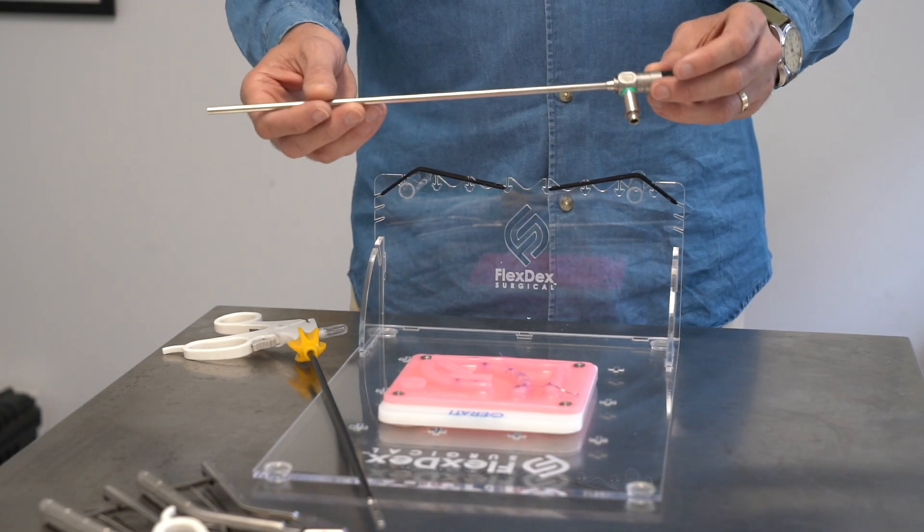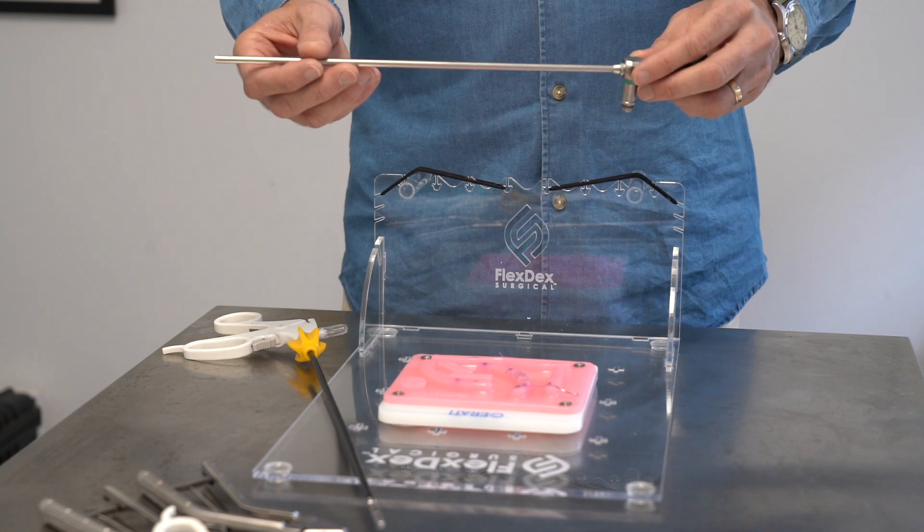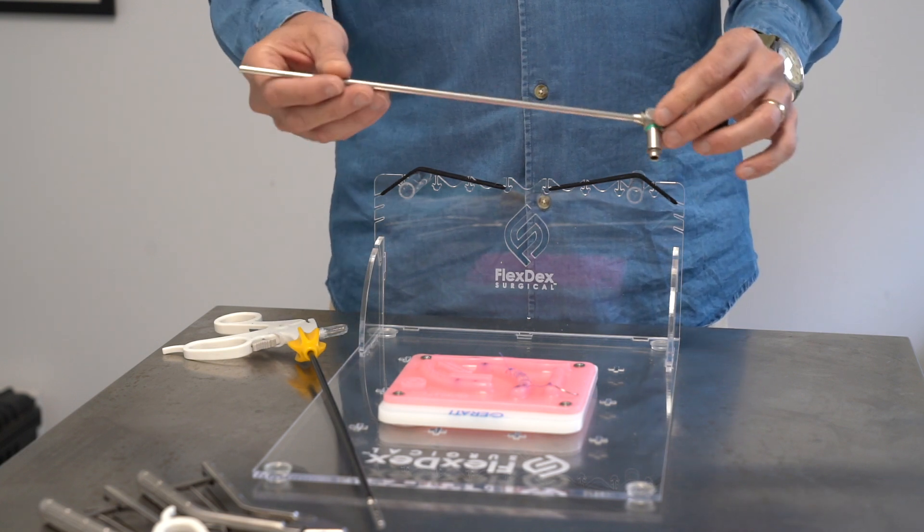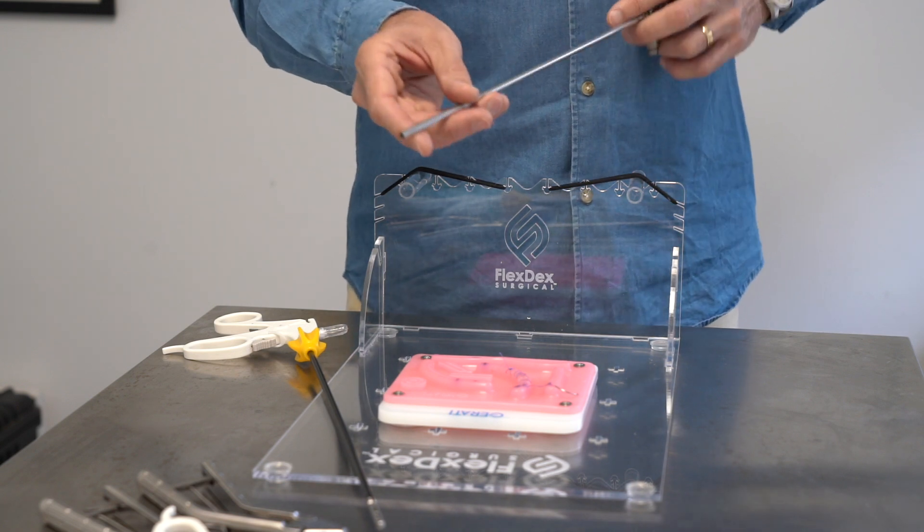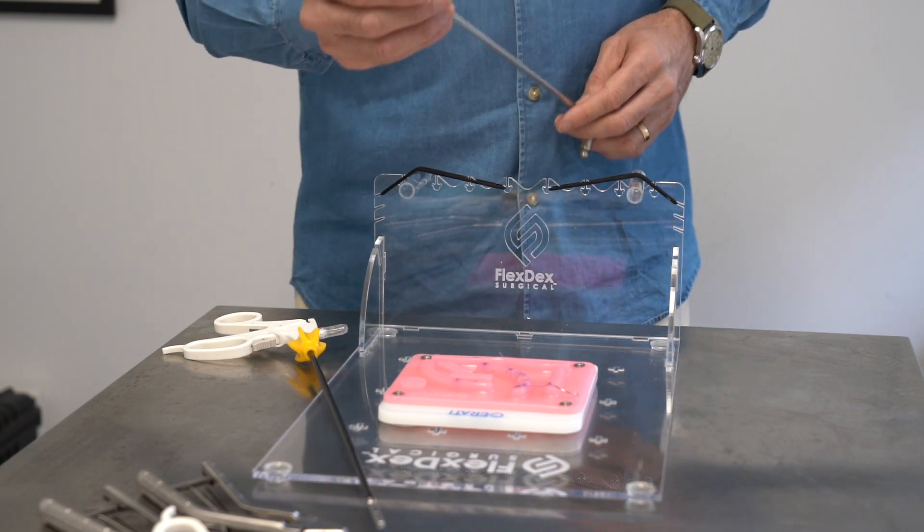This is the laparoscopic telescope. They come in numerous different sizes. This is a 5.0 millimeter laparoscope with a zero degree offset, which means that whatever the scope is pointing at is exactly what you see in the camera.